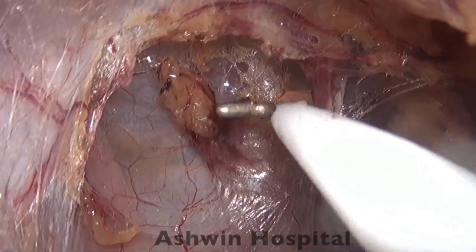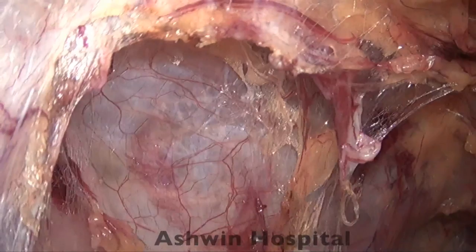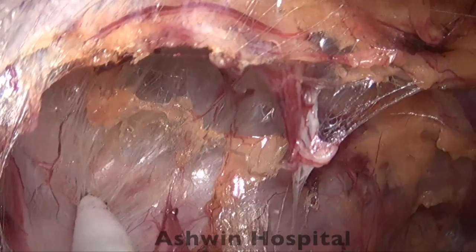So now we have actually started to open the lateral space of Bogros on the left side. You can start to appreciate the inferior epigastric on the roof, and we are just working lateral to it. So even this dissection can be done well with just a single instrument. You don't really need an assisting hand to do this. But if you're finding some difficulty, it is better to use an assisting hand.